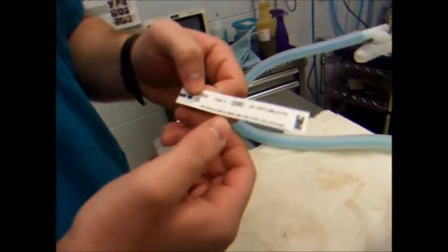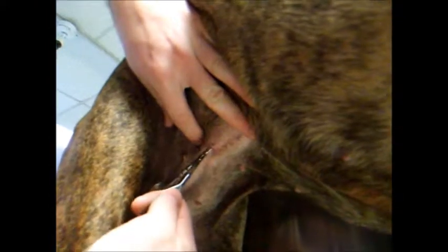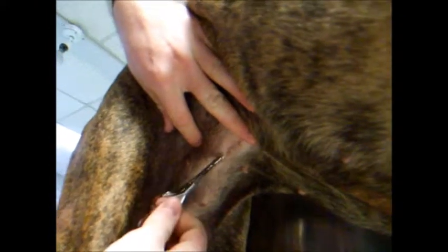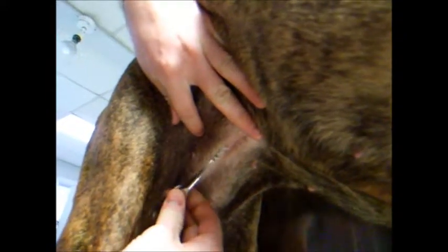Alright, I'm going to go ahead and remove a staple from Lacey here. So as you can see, it's down here. And we're just going to take our staple remover, get in there, and pull it out.